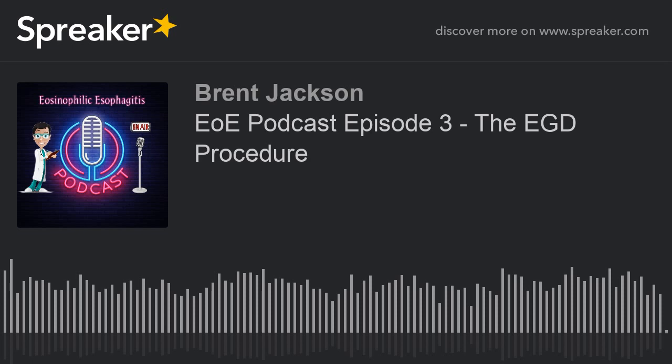And then what happens is you get done, it's going to be sore, you're going to drink water, you're going to wake up, the doctor's going to come in, and they're going to tell you about what they found. And here's what you want to know. You want to know, okay, what did you see? You want to know where did you biopsy? How many biopsies did you take? And where did you take them? Like top, mid, lower, just one in the middle, or how they did it. And obviously you want the more the merrier, the better accuracy if they take more biopsies.